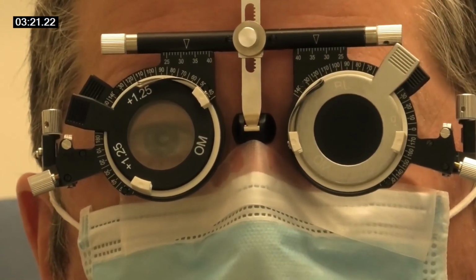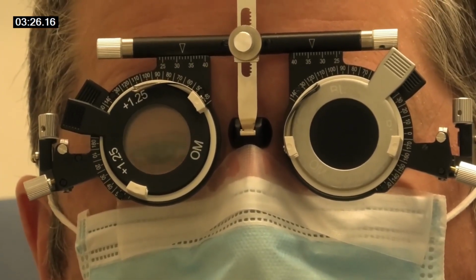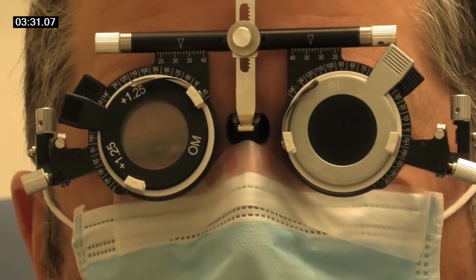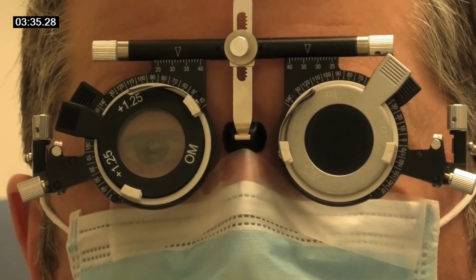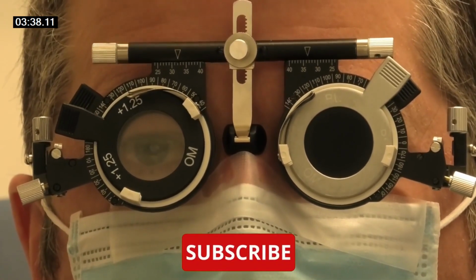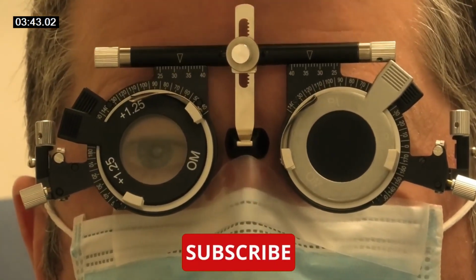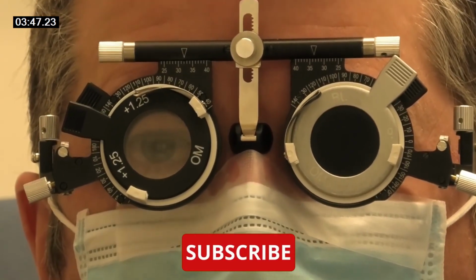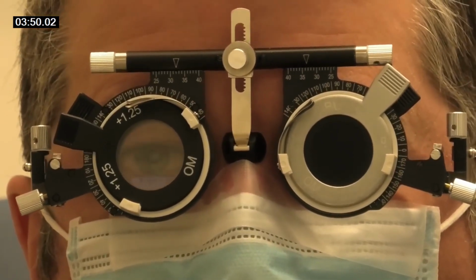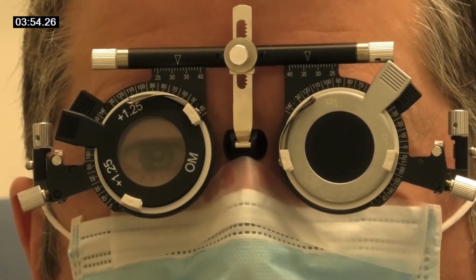Is it supposed to be blurry but I can read it? So are we doing the monocular technique or the binocular technique? Monocular. Okay, good. That's fine. So we will do this eye, then we'll do that eye, and then we'll balance that out later. Okay. So we can do the blurring up of that one later. Just carry on this side. Yeah. Okay. So no problem. You were going to change that one. Yeah. Okay. Just carry on with this one if you're going to do this one.